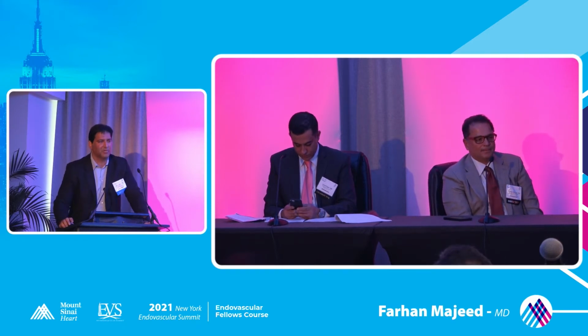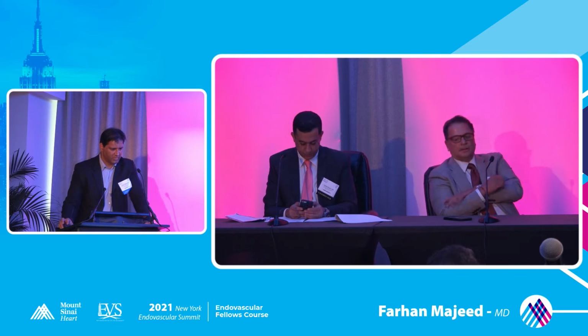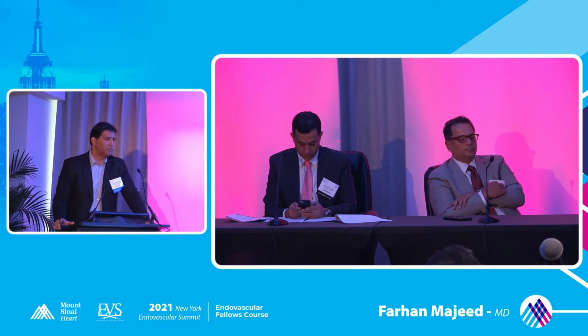Replay the pictures. Can someone go back? I don't know how to go back on this. So that's your prox. This is your mid that's occluded within the stent. And there's your distal reconstitution. Okay, so 014 with an 035 catheter.